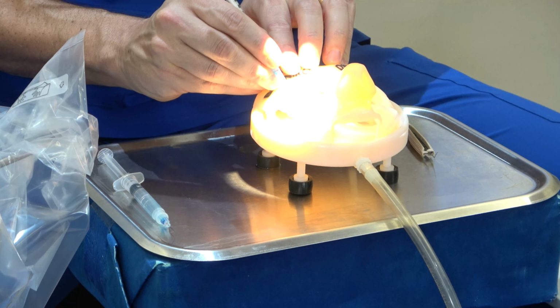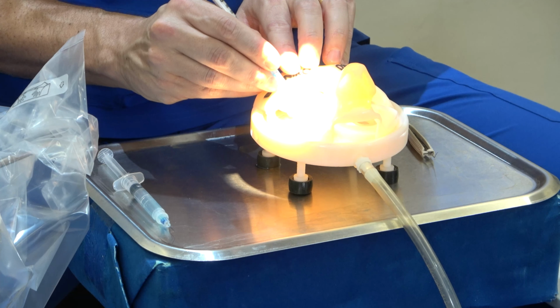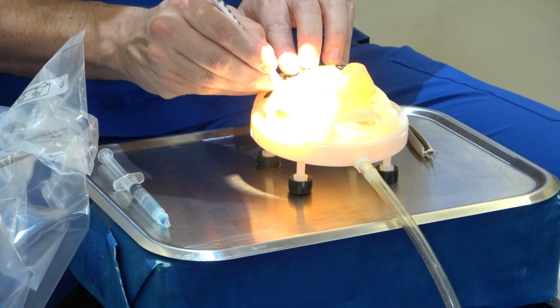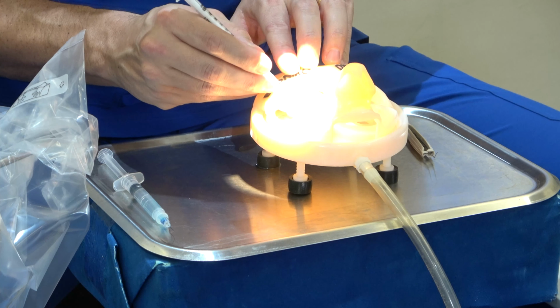As I said, capsular rhexis. There you are. Here I have the flap.